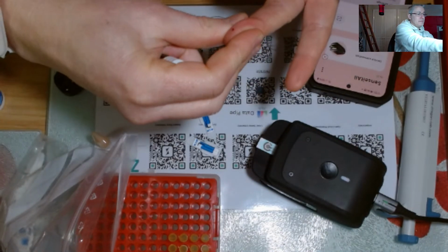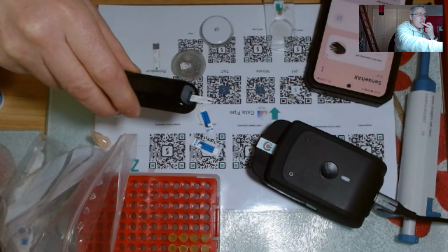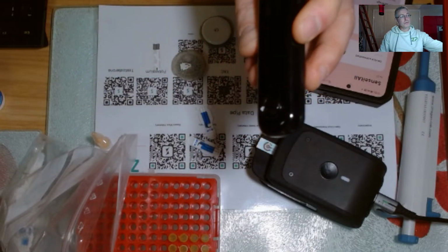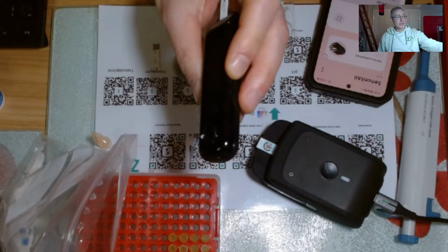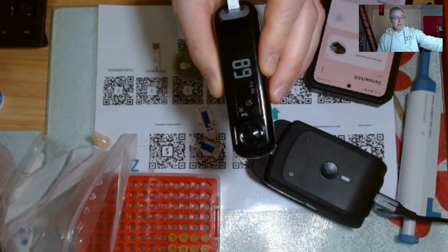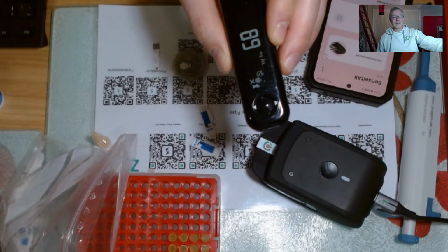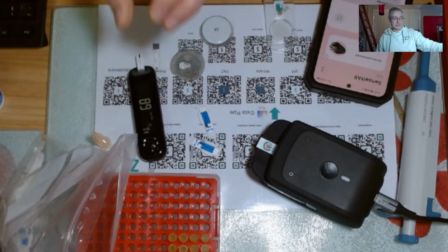Ow. Right, let me get the blood. Right, now the reason I just did all that is because I want to make you realize what ZP, the parameter that we work on, is. That's my blood glucose, 89 milligrams per dL, which is a bit low. 90 milligrams per dL is kind of, well, it's within experimental error, or the error of this machine, that's probably exactly on.